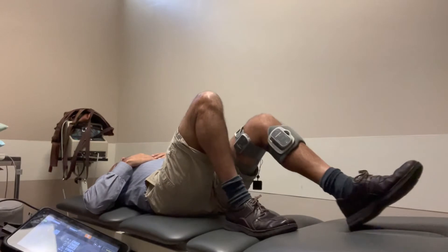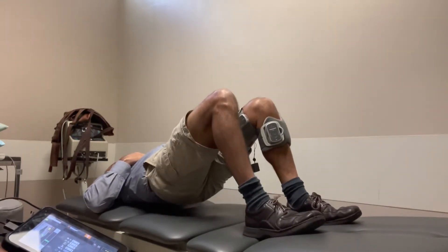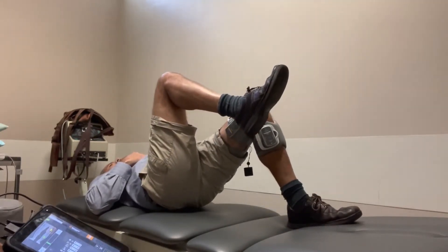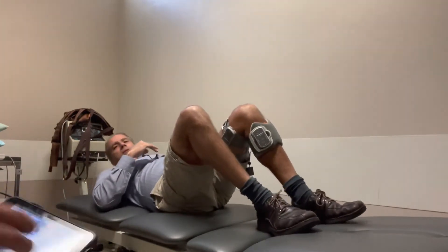Next in this position would be bridging. You can do this in all the positions you're used to — two leg, one leg, BOSU ball under the foot, whatever works for you. Next we will move to sitting position.